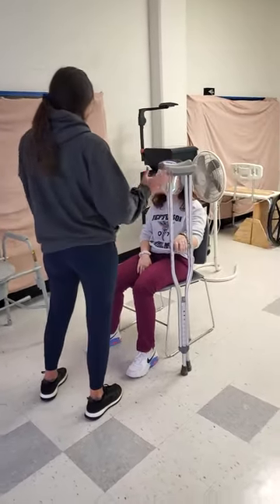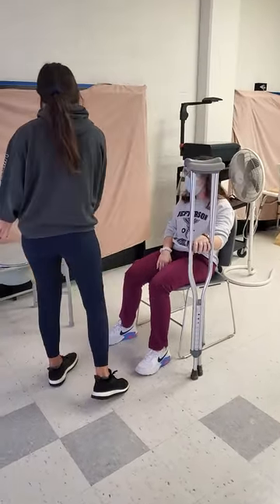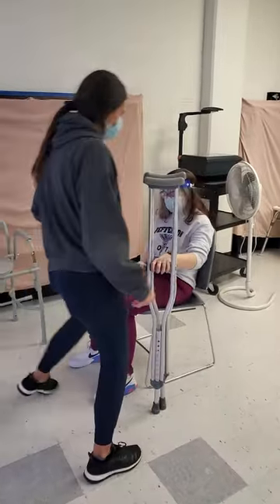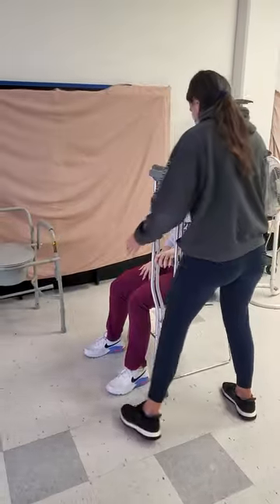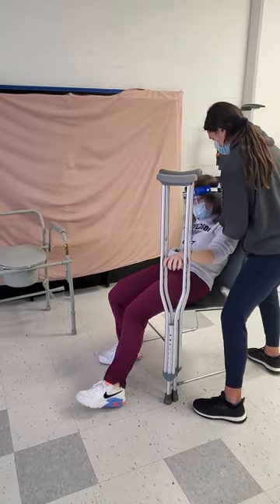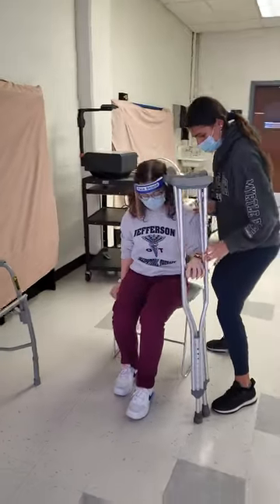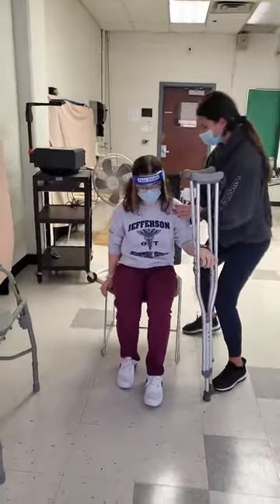We're going to be transferring from the chair. Your crutches are going to come over here. We're going to scootch up. And then on the count, we're going to stand up. You're going to use this, and you're also going to put your arms off your chair.